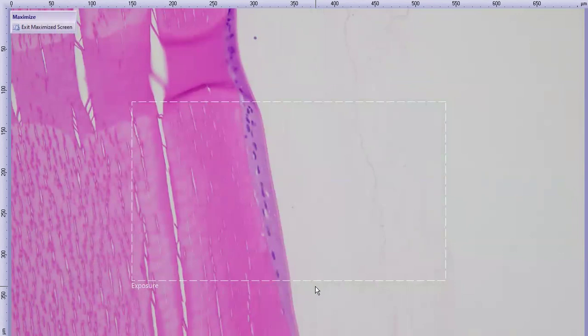So this is one of the earliest presentations of cataract that we get histologically, just migration of the lens epithelium posteriorly. We call this posterior subcapsular cataract histologically. It's really mild, really early cataract. And the reason why it's interesting to look at cataract in a case like this, lens-induced uveitis could be a cause of lymphoplasmacytic uveitis. So we want to see the severity of the cataract relative to the severity and extent of the uveitis and kind of compare them. And that can be worthwhile to try and figure out a case.